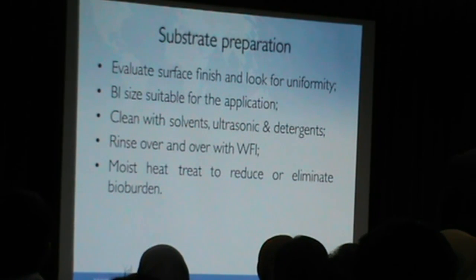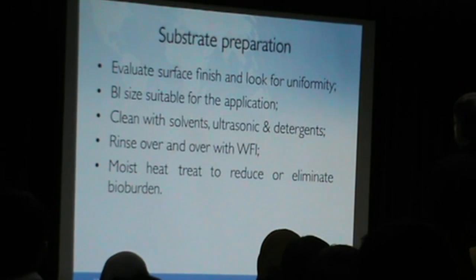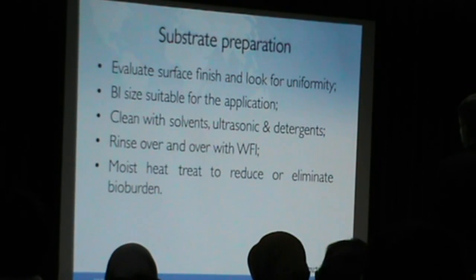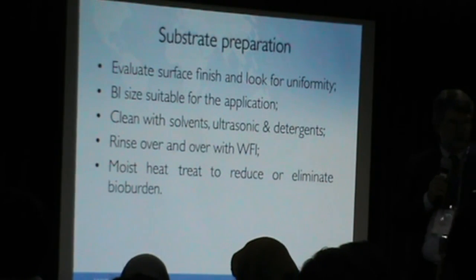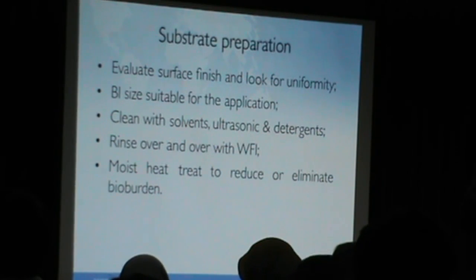So you need to clean carefully, rinse, and then some of the manufacturers also apply a sterilization process to eliminate any trace of bioburden, existing bioburden.